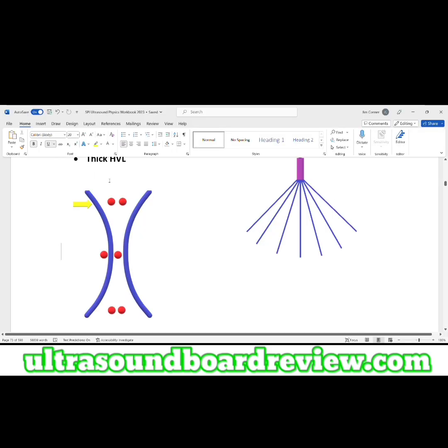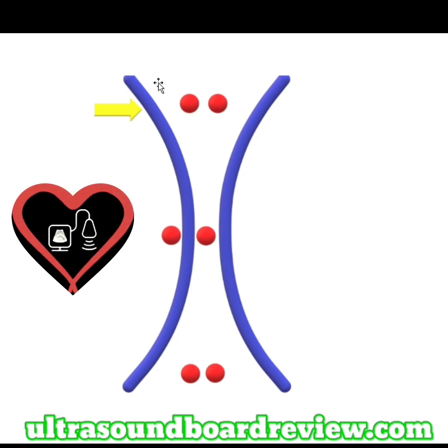So this diagram here represents the beam. The crystal would be right here. As the ultrasound beam exits the transducer, it will converge. It'll converge to a single point called the focus. This is the narrowest point of the beam.